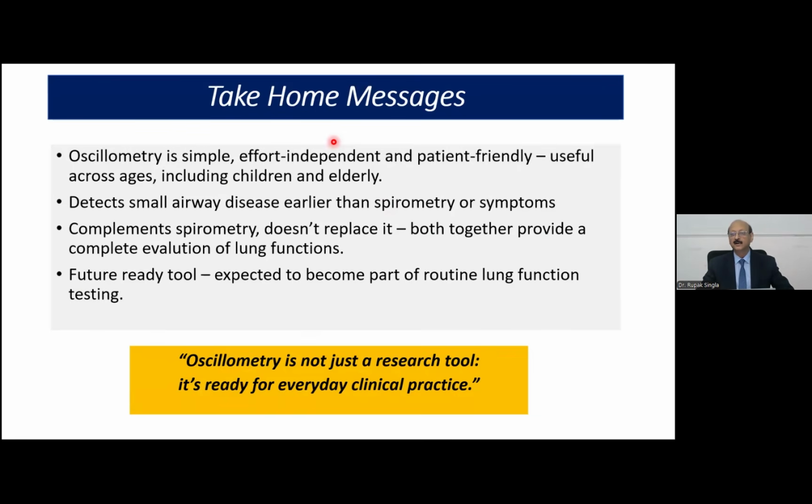So it's a future-ready tool, and it is almost there to become part of routine lung function testing. So please remember, oscillometry is not just a research tool now, it is ready for everyday clinical practice.